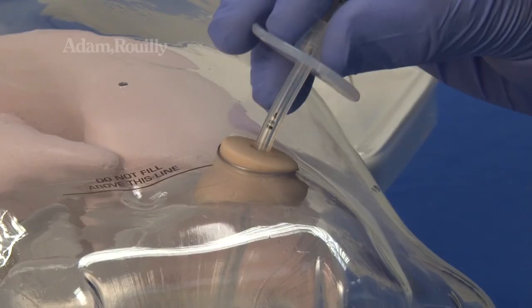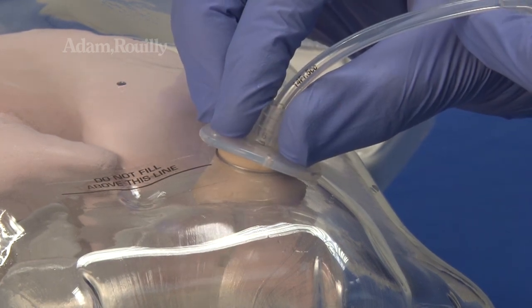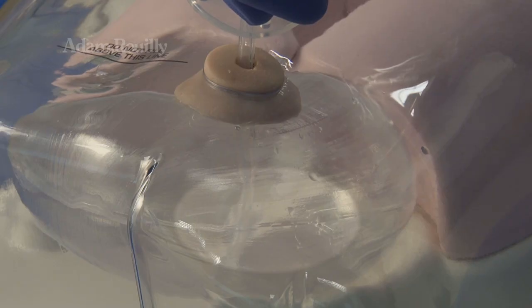Insertion of gastrostomy devices, inflation of the gastrostomy device balloon, and administering via gastrostomy is also possible.